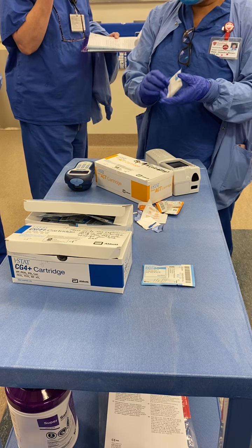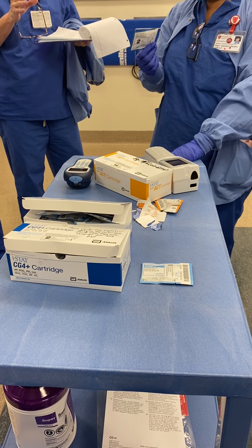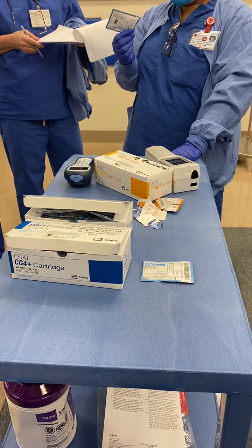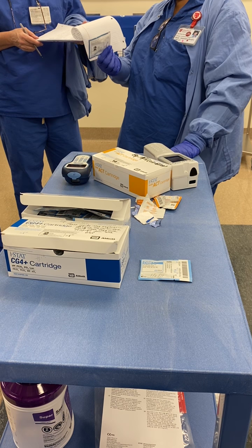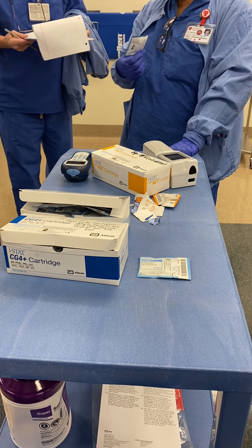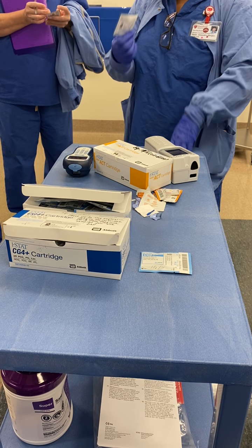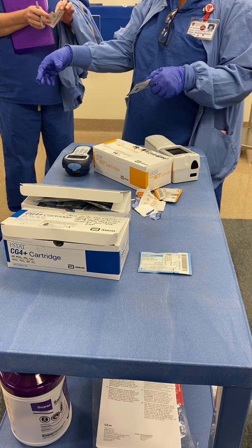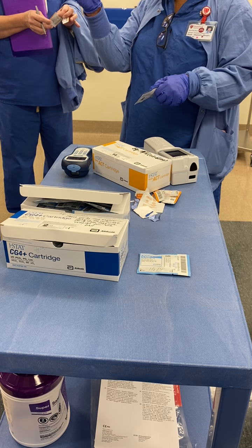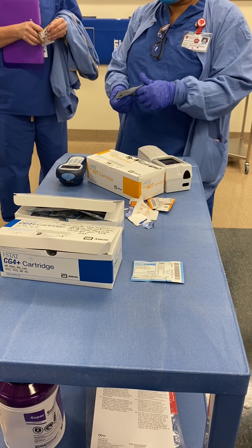Okay? So, are these things accurate? It depends on what you're comparing it to, but yes, to some degree they are accurate. However, I do know of an anesthesiologist who is doing a study to compare the results of this with the results of the blood gases, like the lab tube you give to the lab and they run it. They're going to compare the numbers, okay?